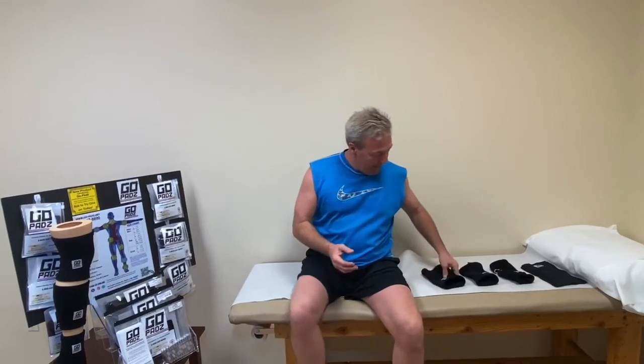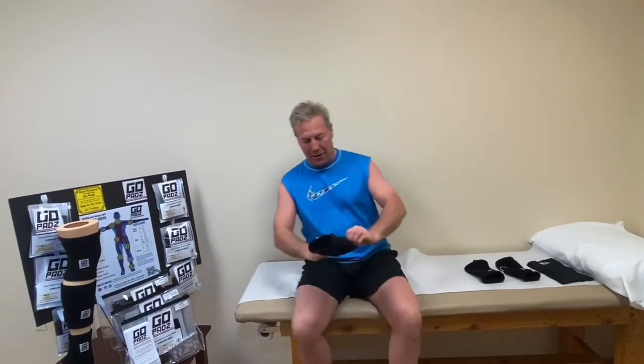When I was recovering from my own knee replacement surgery, I have to say that using the GoPads system helped me recover. They have something really cool called the stackable compression system.